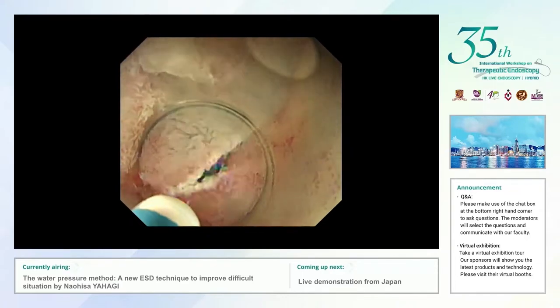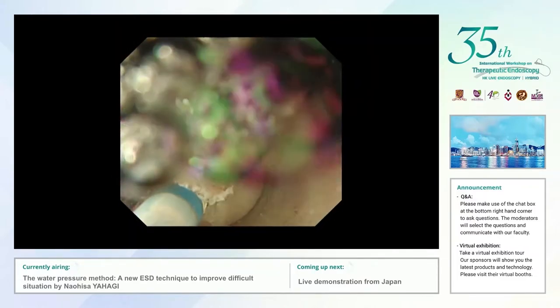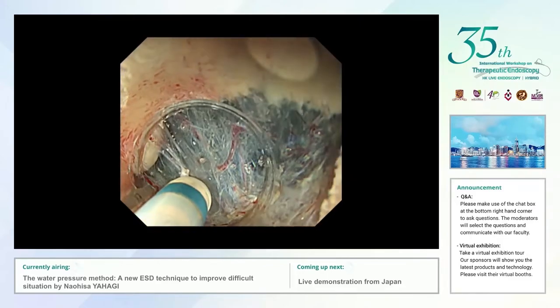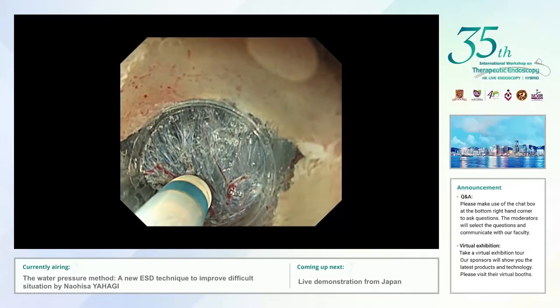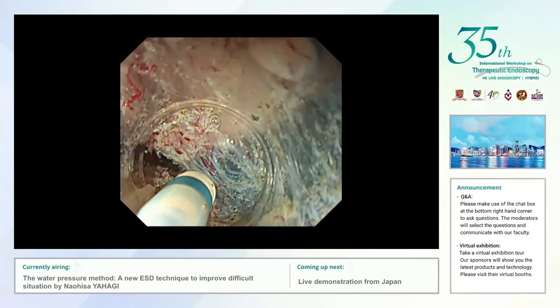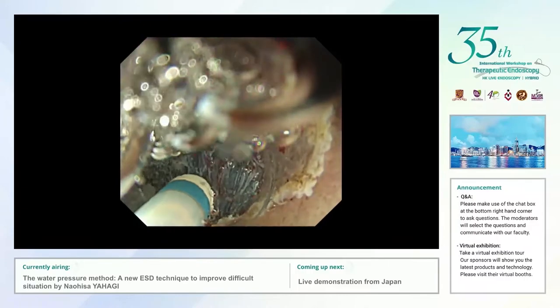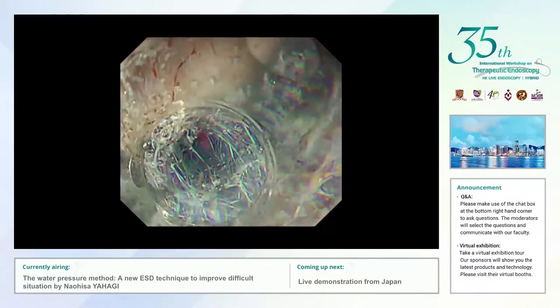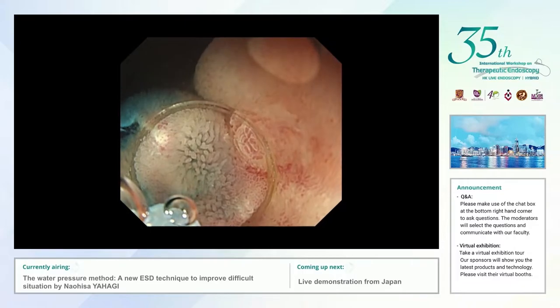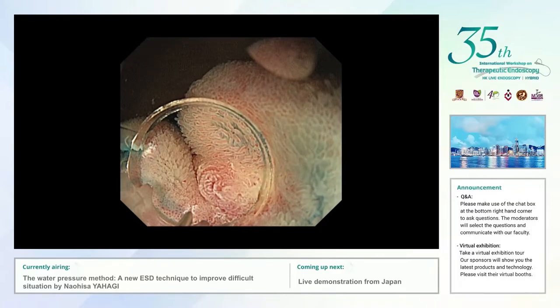After connecting the mucosal incision, I again applied active pressure to the submucosal layer, then quickly started submucosal dissection using Swift Coag. We can see the beautiful submucosal layer stained by indigo carmine, and the following submucosal dissection became relatively smooth and easy. I carefully checked the remaining submucosal tissue and dissected it smoothly by using the right-left channel and torquing my wrist. For the remaining mucosa very close to the major papilla, I decided to use a viscous agent, which is sodium alginate.